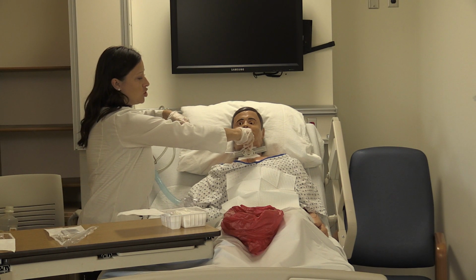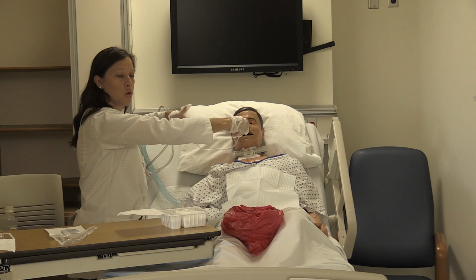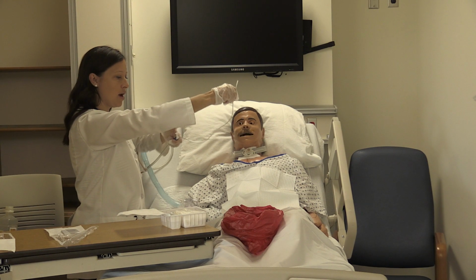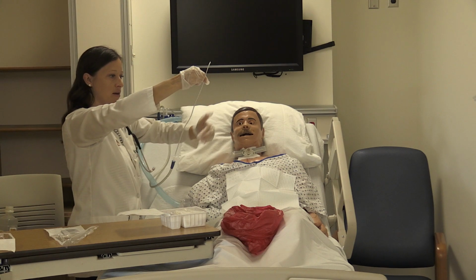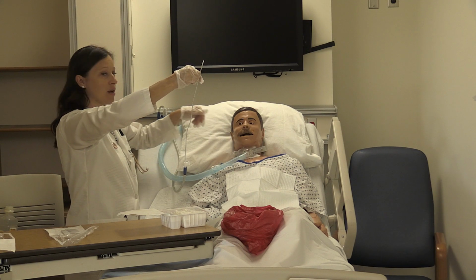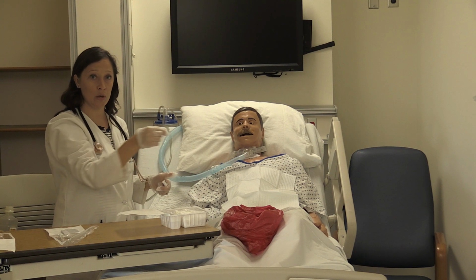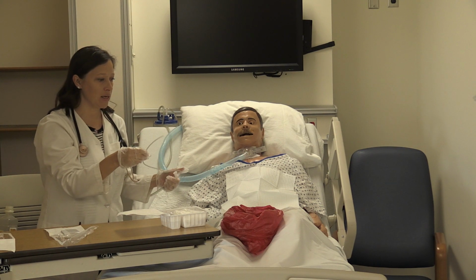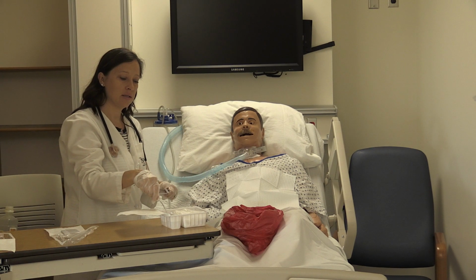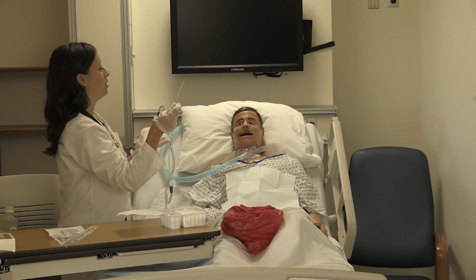So twisting, intermittent suction. And you don't want to do this for more than 10 to 15 seconds because you're basically taking the patient's breath away. So they're going to be holding their breath basically for this whole time. So once you pull the catheter out, you want to hold it up like this so none of this gets contaminated. And then you want to give them oxygen again so that you can hyperoxygenate them, let them rest. You want to generally let them rest a minute or two between suction passes. While he's resting and while he's being oxygenated, you can then suction the remains of the secretions out of the tubing, clear that out.